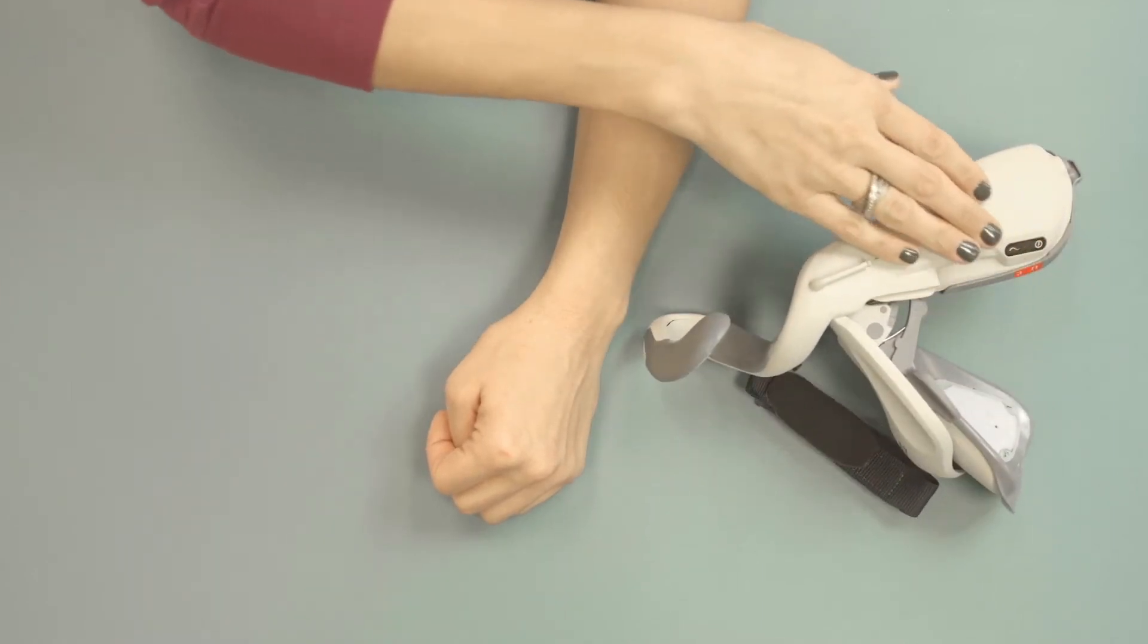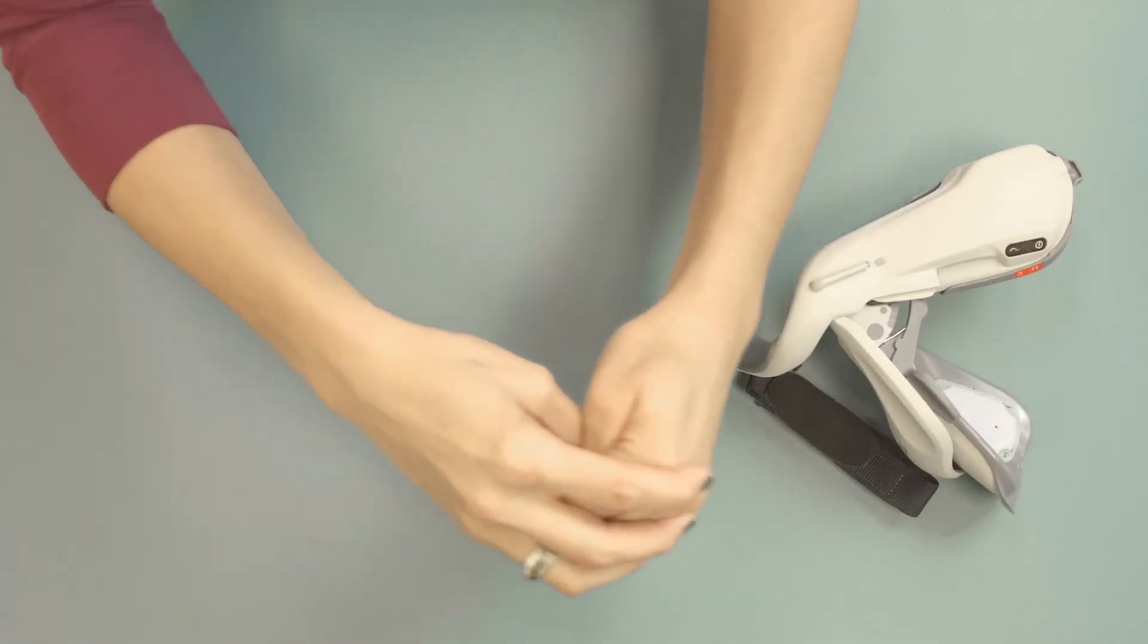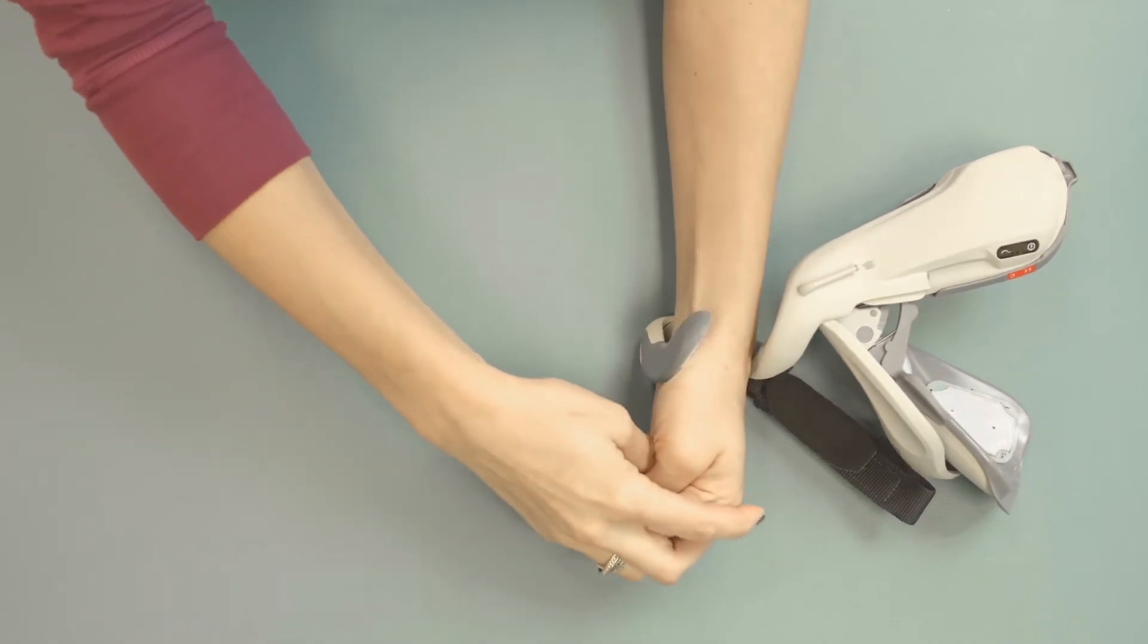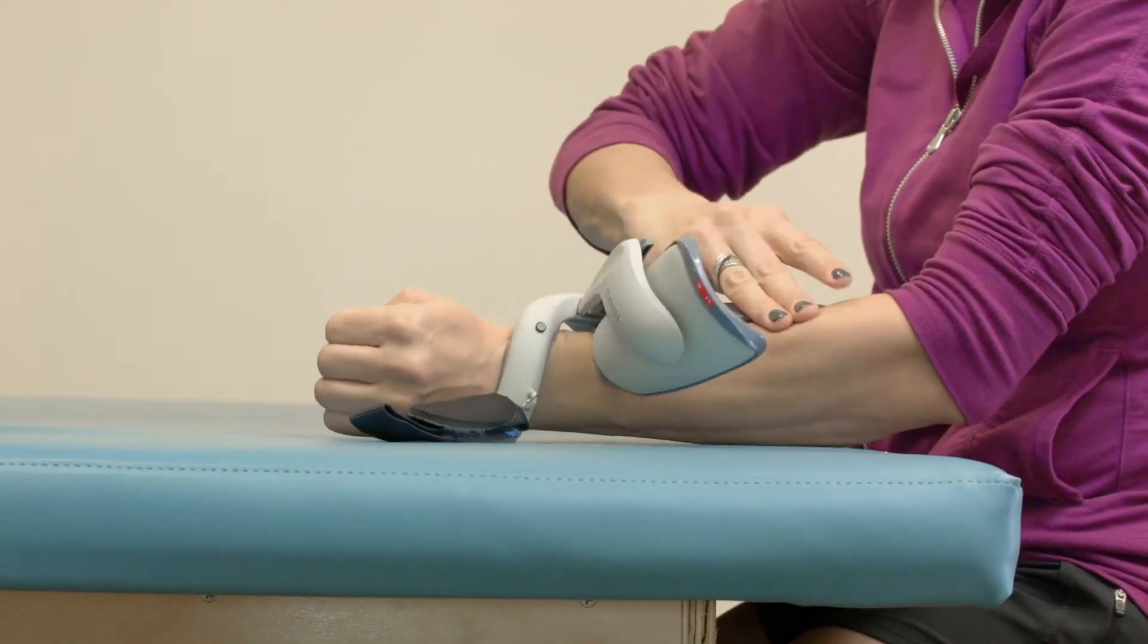Reorient the orthosis so that you can easily place your wrist in the spiral end, and then bring the orthosis flexor support to your forearm.